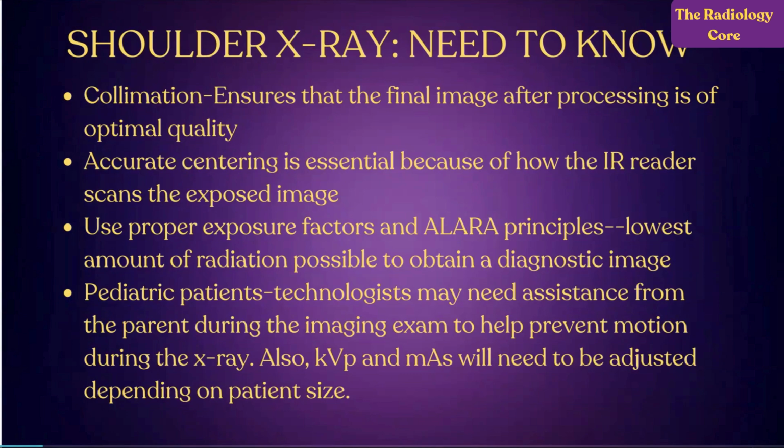And with pediatric patients, technologists may need assistance from the parent during the imaging exam to help prevent motion during the exam. If the parent is a female, make sure you are asking them if there is a possibility of them being pregnant. If they are, then you do not want that parent staying in the room.